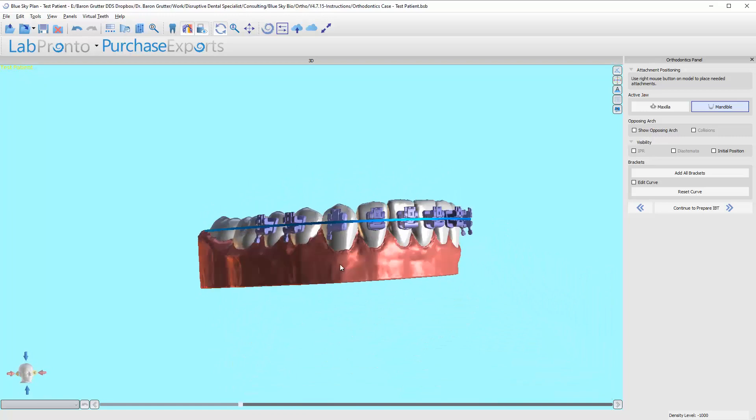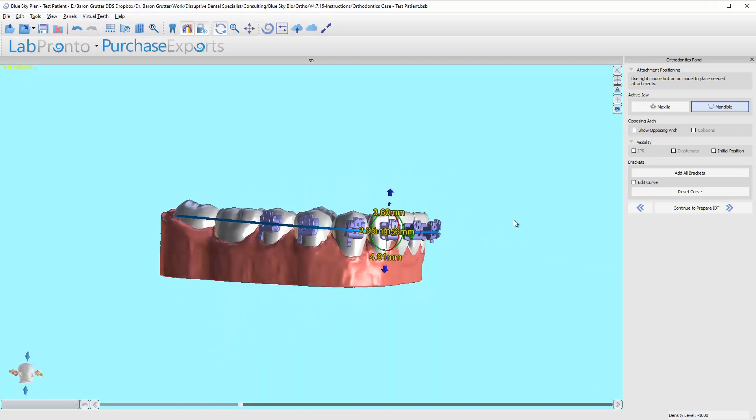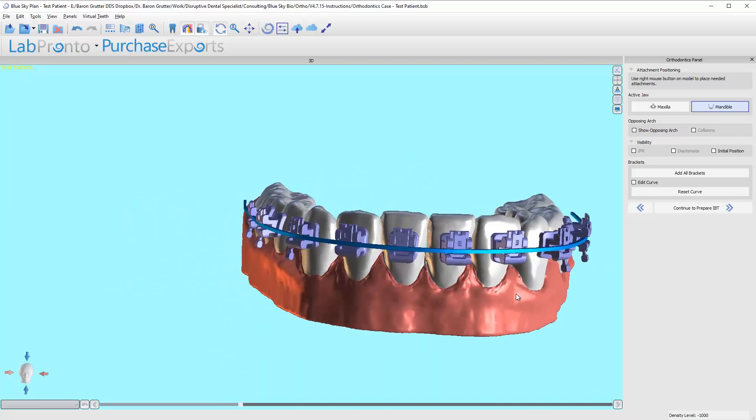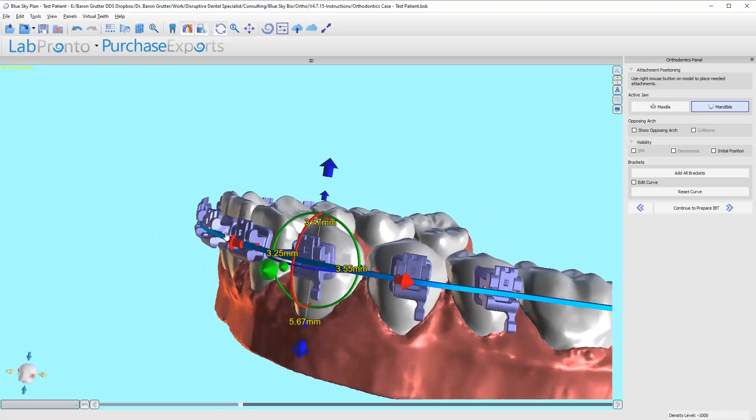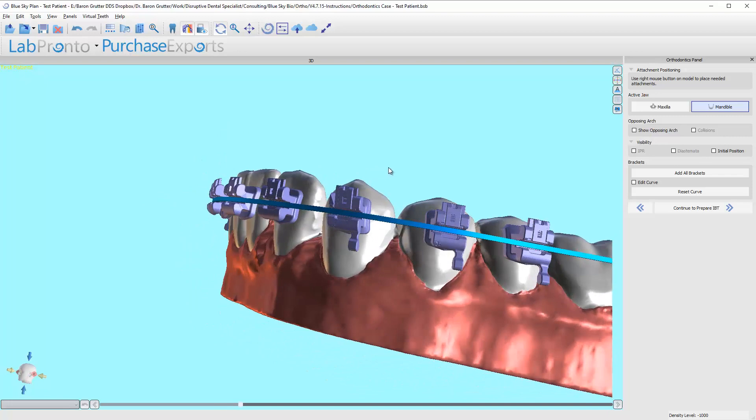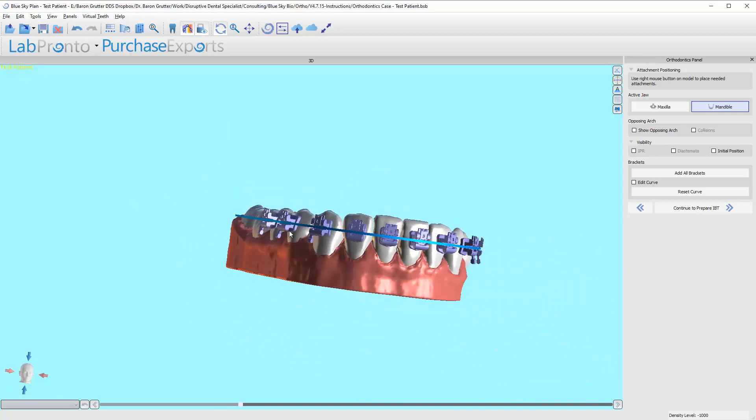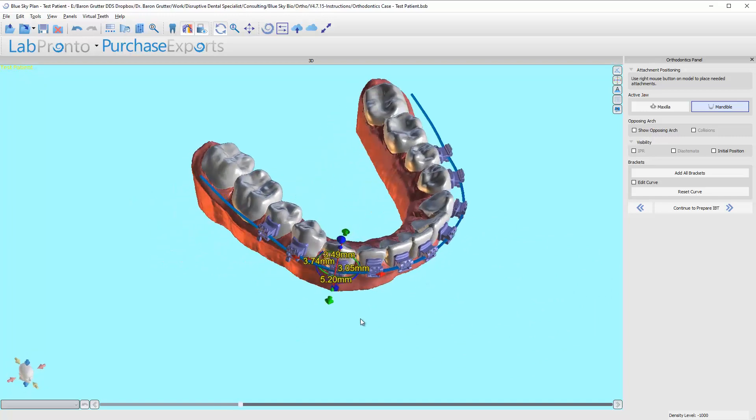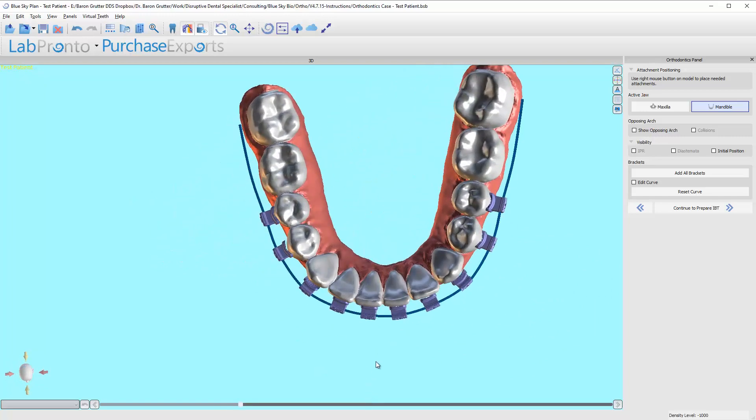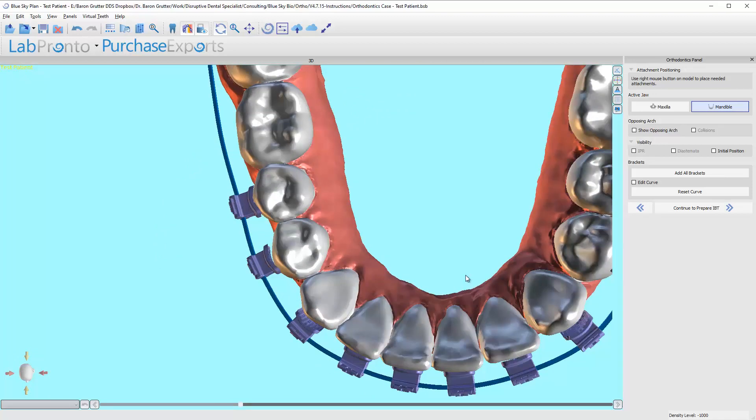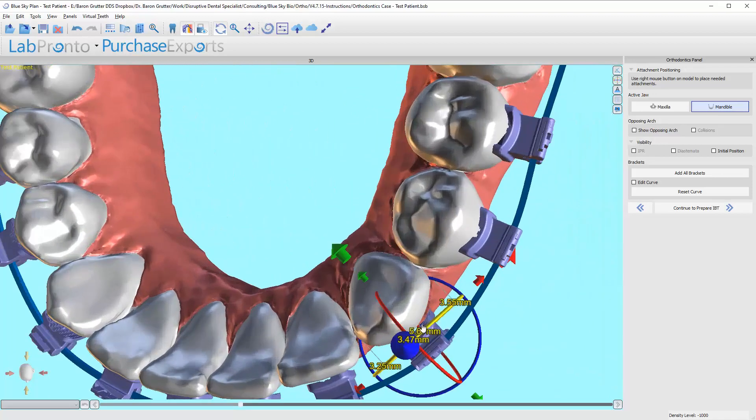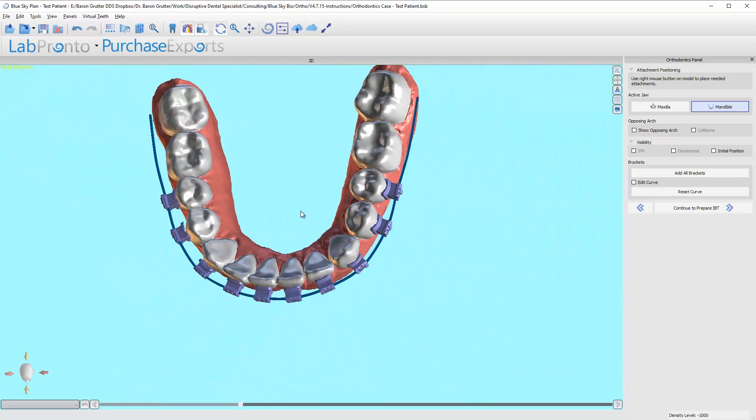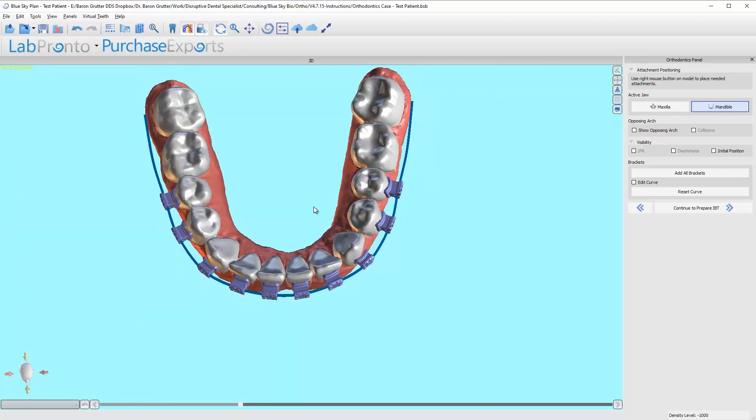The reason that's there intentionally is these brackets are generic. They're based on a prescription and the angles of the channels are all designed from a perspective of all teeth are the same, but they're not. So what we're doing by having them just contact the teeth but not but no further than that, what we're doing is we're essentially creating a custom bracket pad via cement.